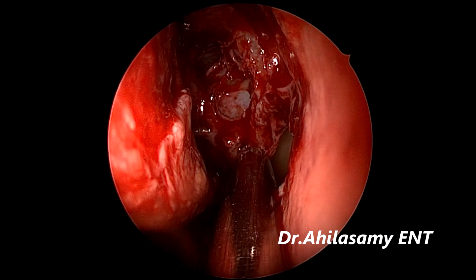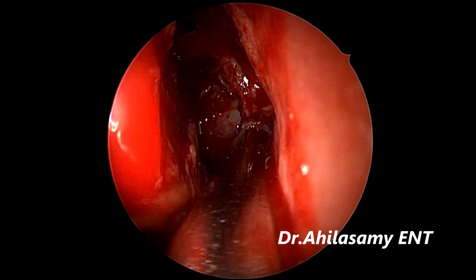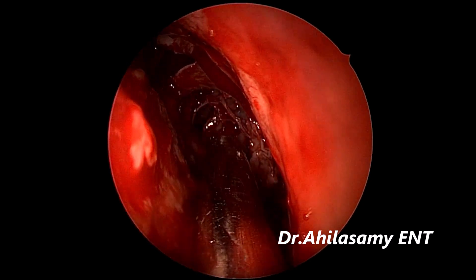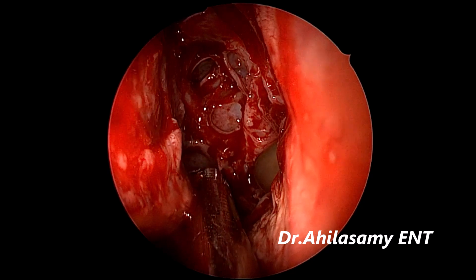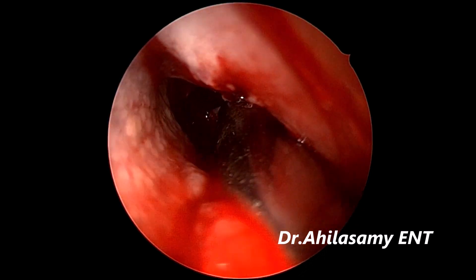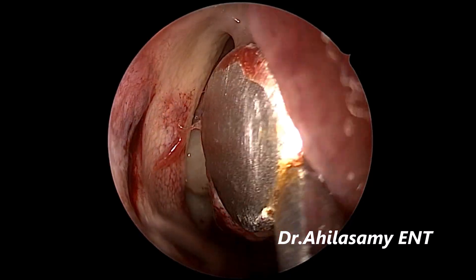Remember I am doing this under local anesthesia. Hardly any bleeding — you don't need to suck the blood frequently as in general anesthesia. There is no need to pack the nasal cavity post-operatively, and you can discharge the patient on the same day as a day-care procedure. Left side antiethmoidectomy has been finished.